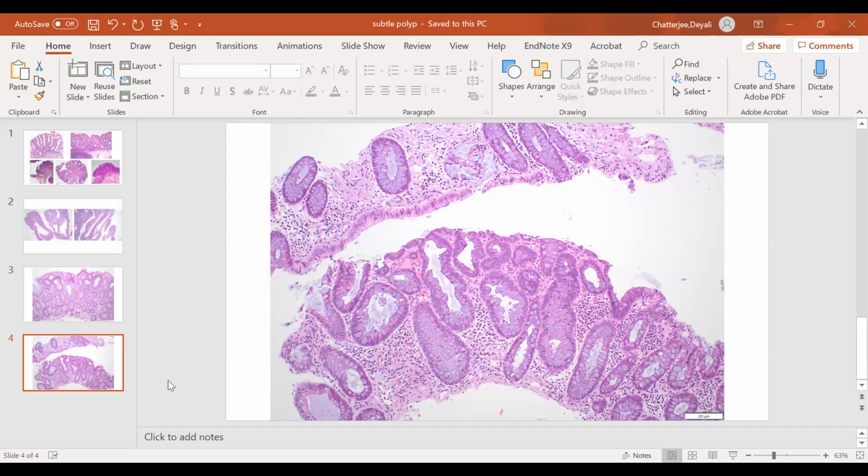Endoscopically, there is no question whatsoever that what Raju has shown over the years, especially the first one, was an SSA. You might want to look at it and ask, in the prior specimens, were there any SSAs in the components that you called tubulovillous? The first lesion that he showed, there is no way on earth I would call it tubulovillous. That was an SSA with the cloud-like appearance of an SSA.